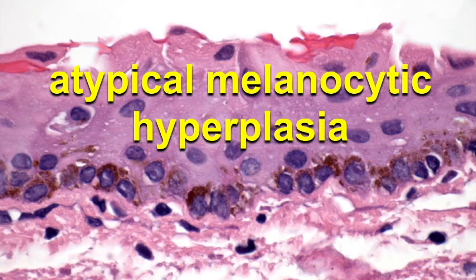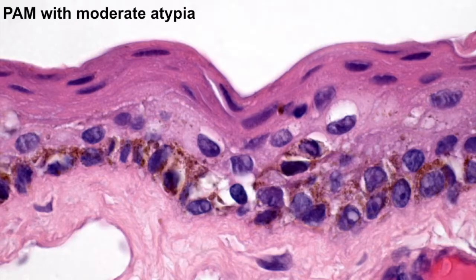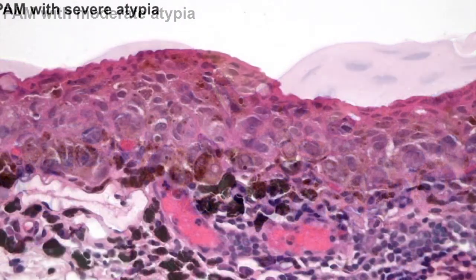Varying degrees of atypical melanocytic hyperplasia occur in this disease spectrum. These photomicrographs show PAM with mild atypia, PAM with moderate atypia, and PAM with severe atypia.